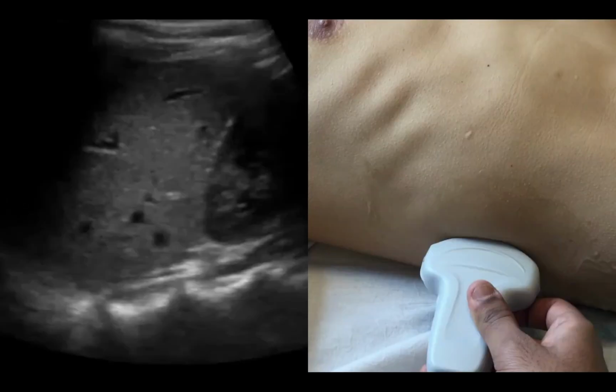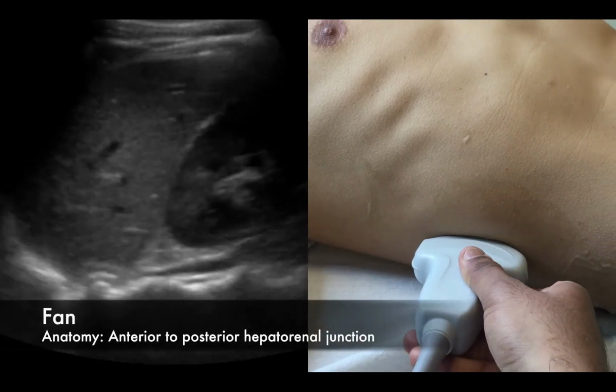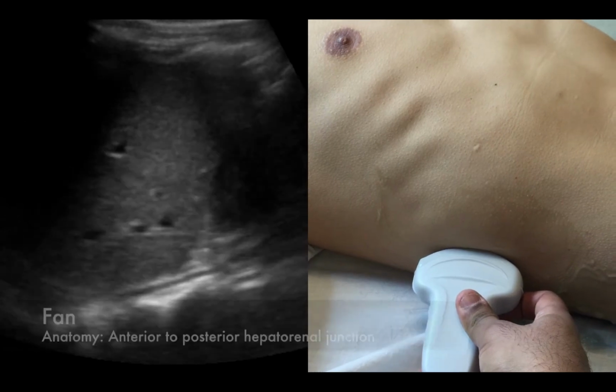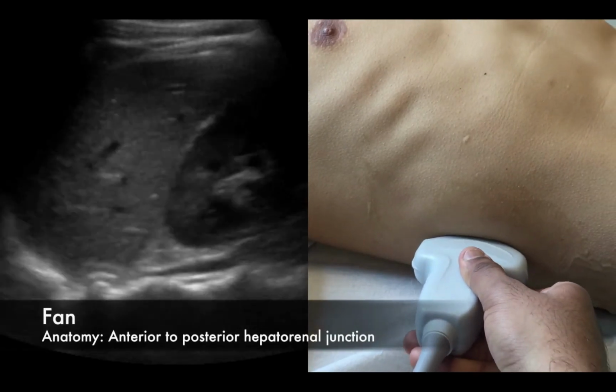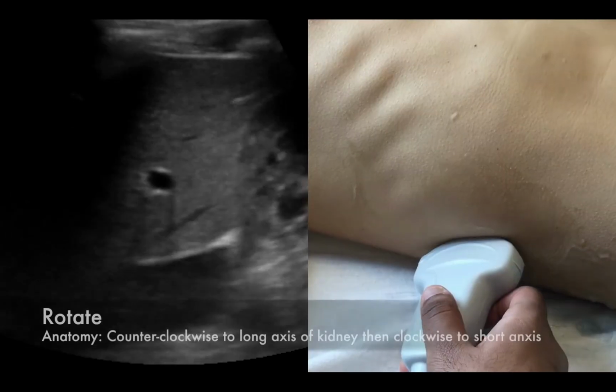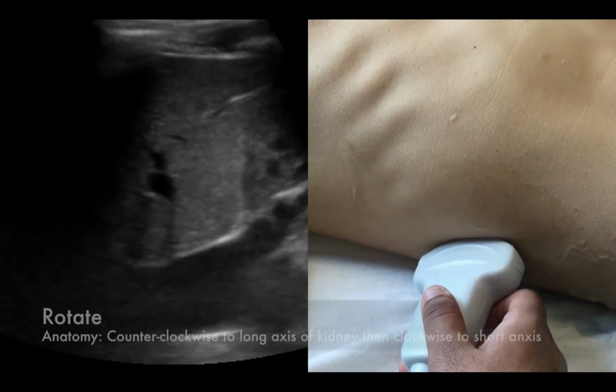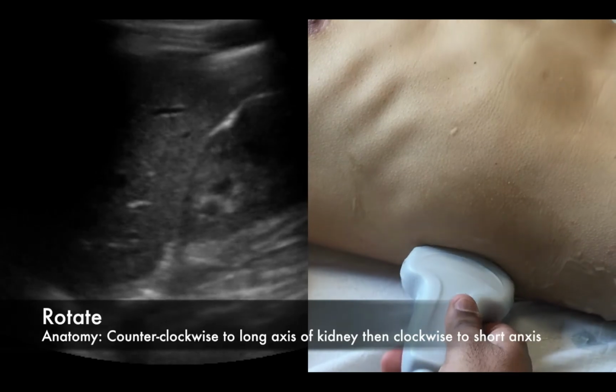If you find a good rib space, sometimes you don't want to sweep anymore, and in this case you can fan the probe in order to scan through a plane. This is analogous to rocking the probe, but in the perpendicular axis. Finally, you can rotate between the planes in order to change from a long axis to a more short transverse axis. Let's summarize these movements.